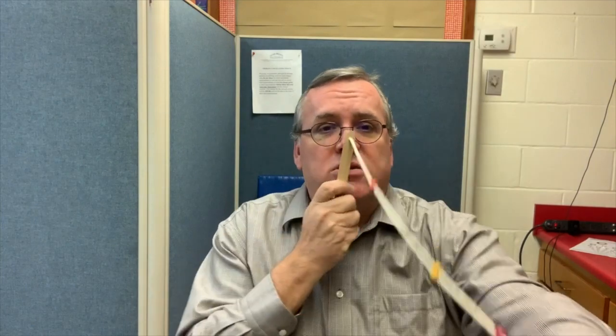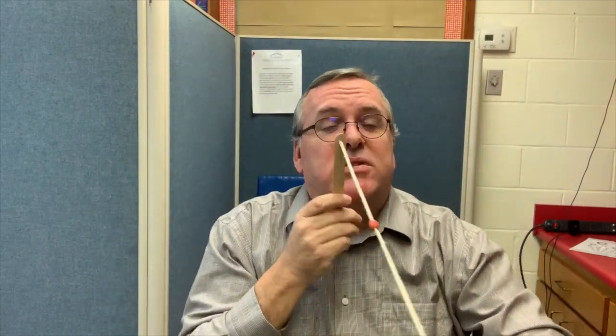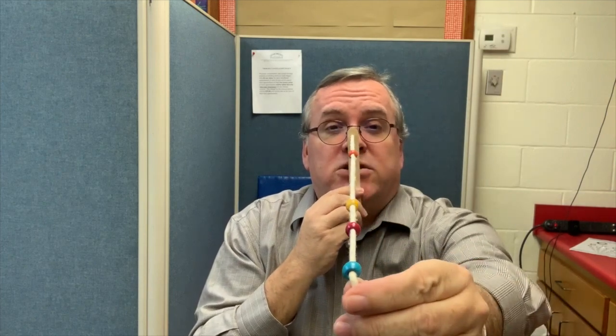In the clinic, my Brock string has a popsicle stick on the end to keep the child's hand away from their eyes. We're going to hold this up, hold the other end, and watch their eyes to see what they're doing. We're going to have them look at the furthest bead.